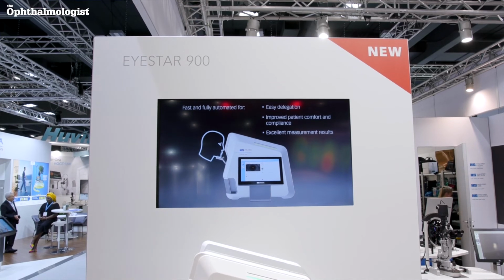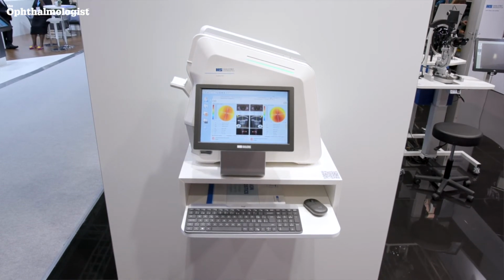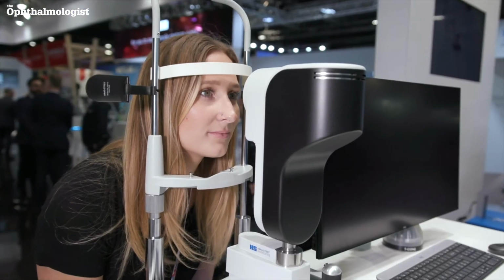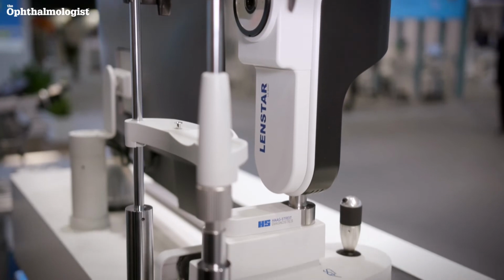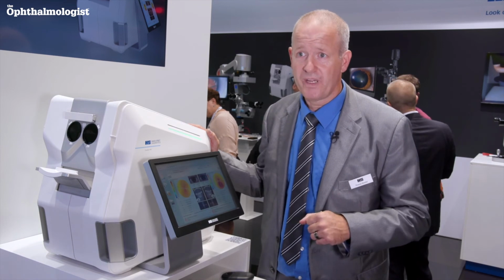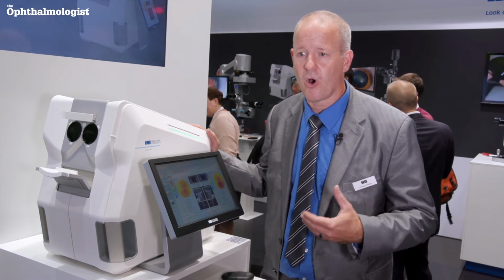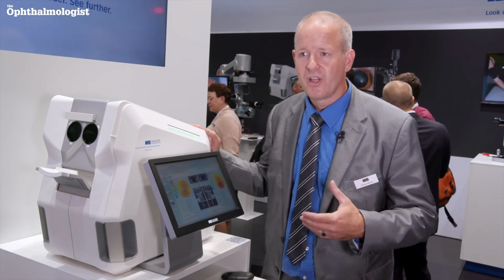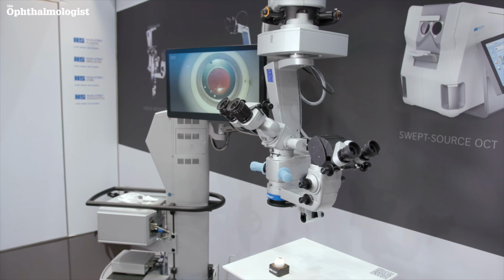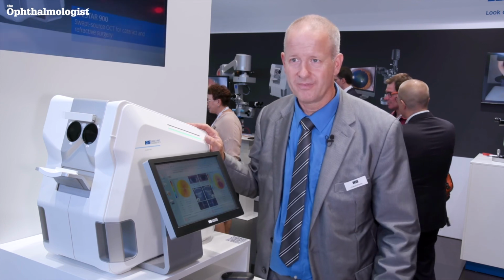So here at the ESCRS, we are proud to, for the first time, present the complete Haag Streit booth on one booth. So we have not only the diagnostic field with the Eyestar for the cataract refractive application, with the slit lamps for general diagnostics, but also with the LensStar for the myopia management. We also have the Haag Streit simulation group here that offers for the training of surgeons, but also of ophthalmic doctors in general, tools to train diagnosis, but also the application. And then we also have in the background the surgical microscope that covers then the execution of the planned procedure from the diagnostic devices.